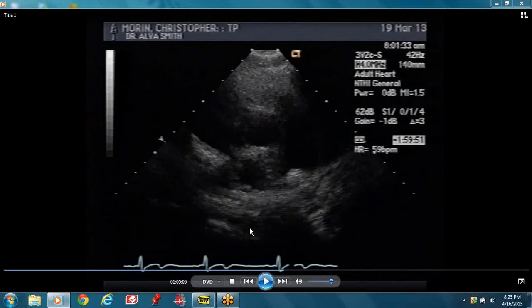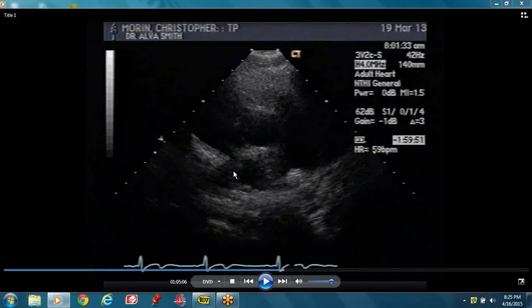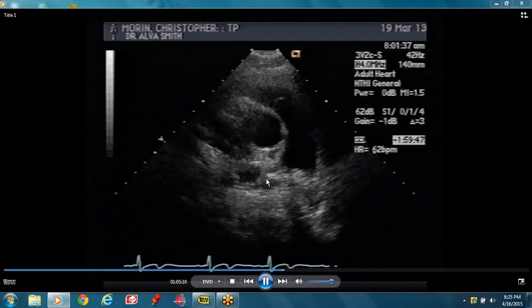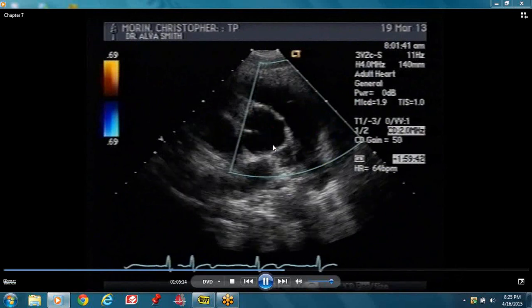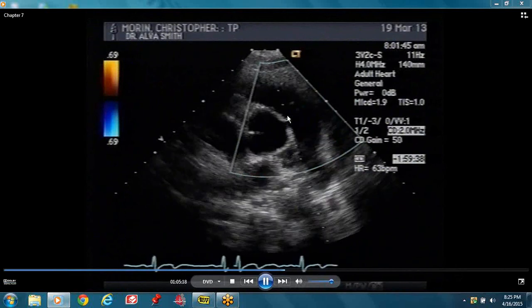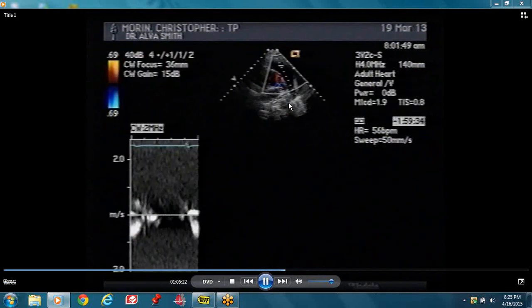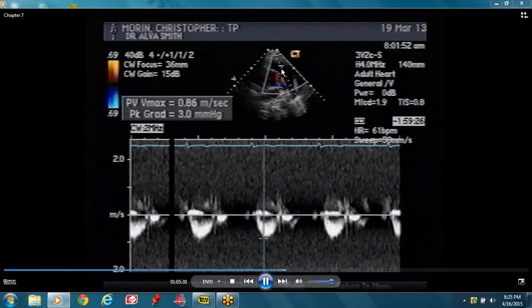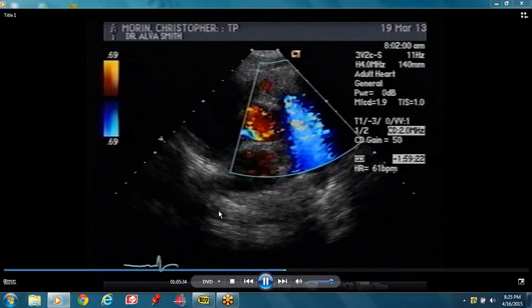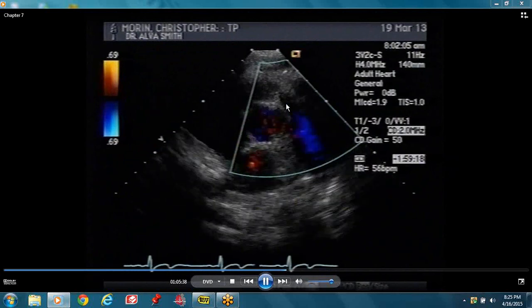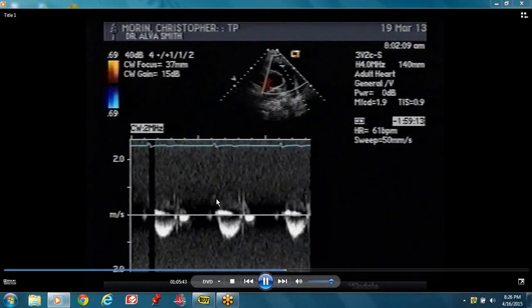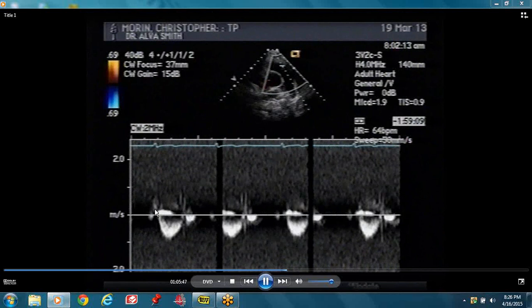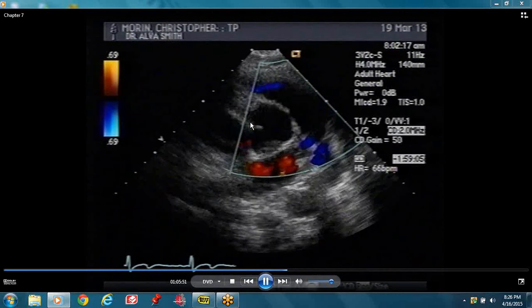The right atrium is right there, your inter-atrial septum is there, and your left atrium is there. You can do a little manipulation to show more of the pulmonary trunk by angling and going down a few intercostal spaces. The Doppler is across the pulmonary valve — you have the color flow and then do the pulse wave Doppler. The pulse wave Doppler is across the pulmonary valve and you get a downward signal because the blood is moving away from the transducer.